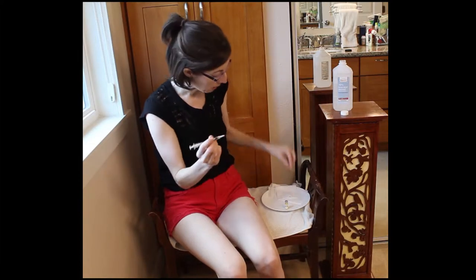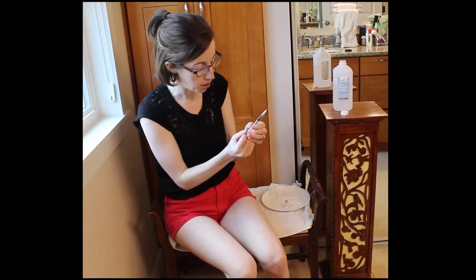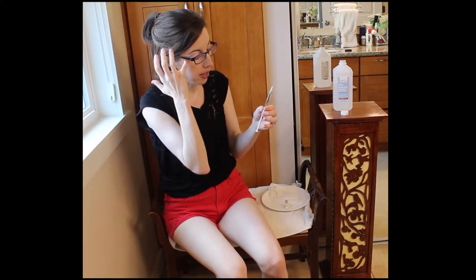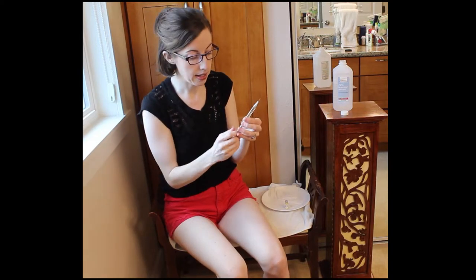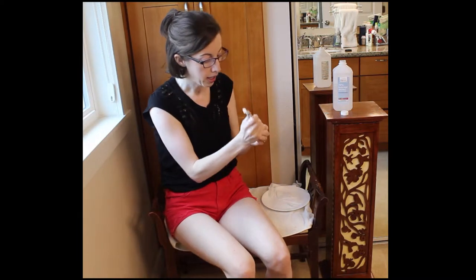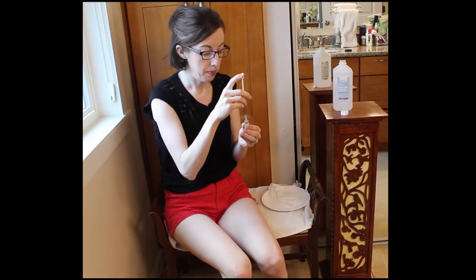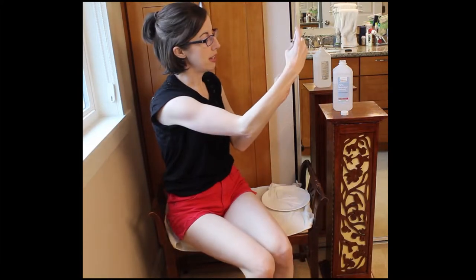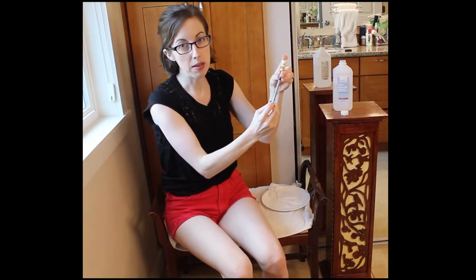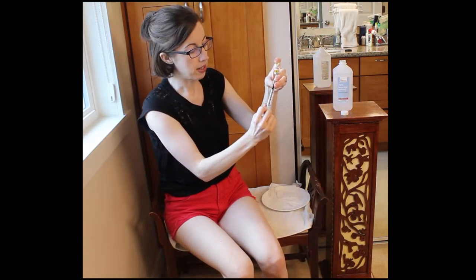Then you take your syringe out. I give 0.8 — that's the amount that I give. Again, it's totally going to differ depending on what your doctor has prescribed you. So I load the air up, and then I put the syringe in and push the air in. Honestly, I'm not positive why you have to do that, but it does seem to make it easier to get the medication into the syringe when you do that.